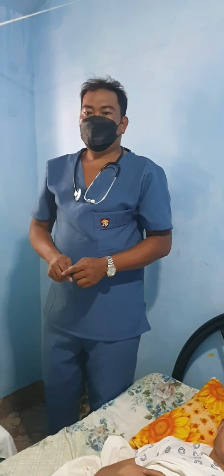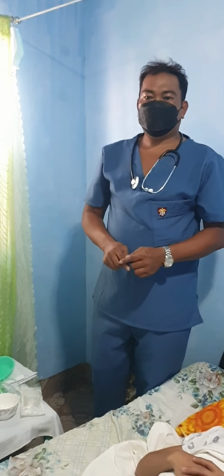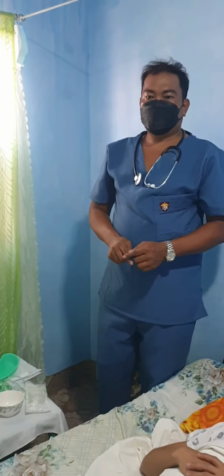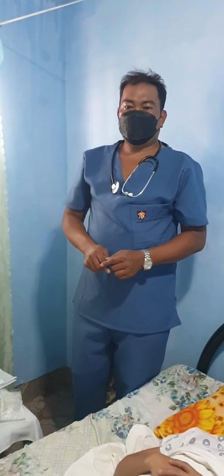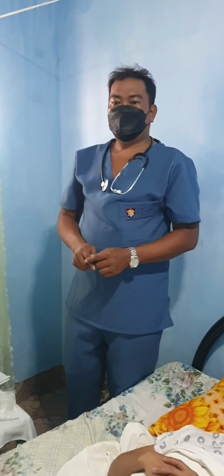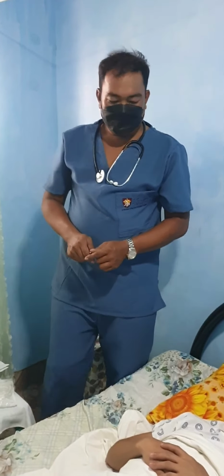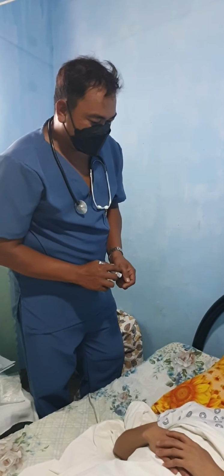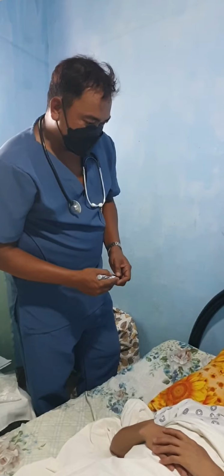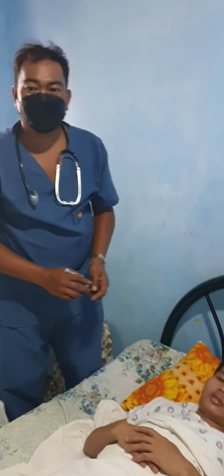Assess for the best nostril before you begin, by occluding one side and asking the patient to sniff. Ask the patient about previous injuries or history of related symptoms. Hi, sir. Do you have any history about your disease? Okay.